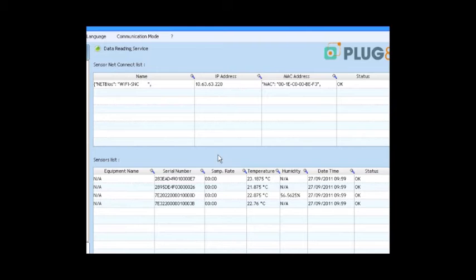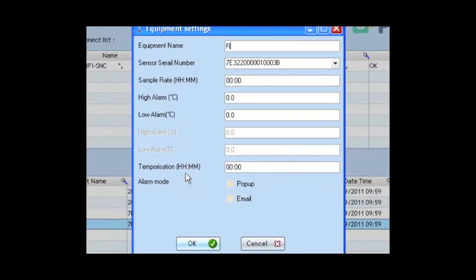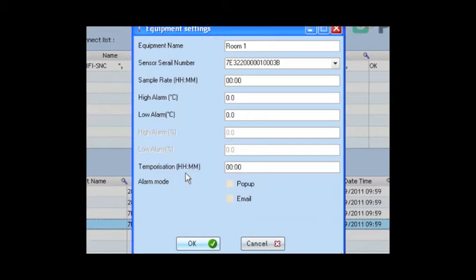Now, you can configure each of them. We can name it, set the sample rate, the alarm threshold, and decide how to send the alarms.